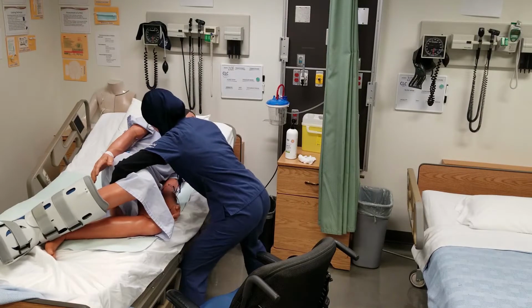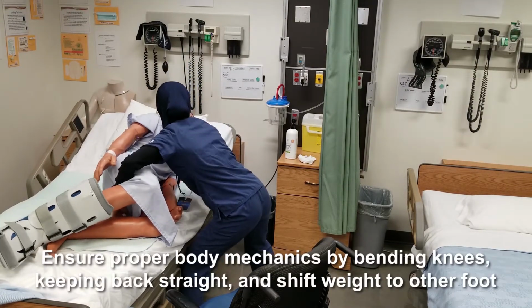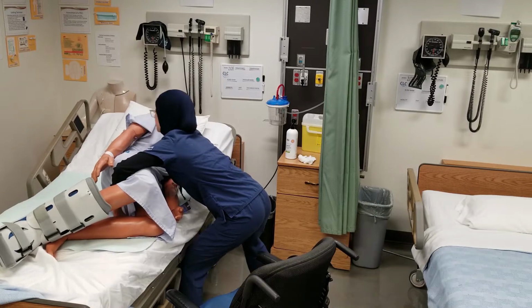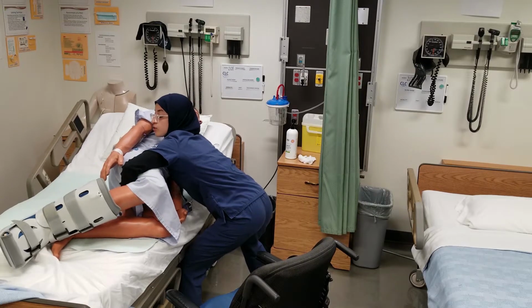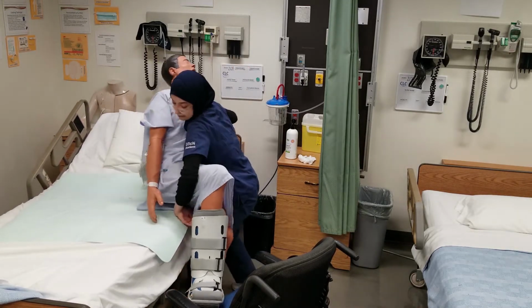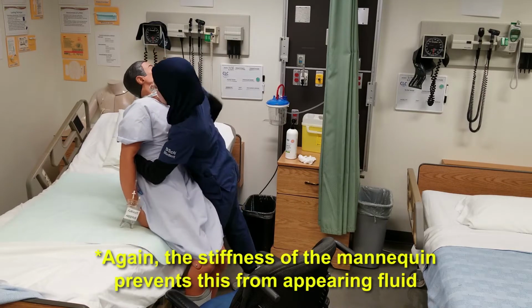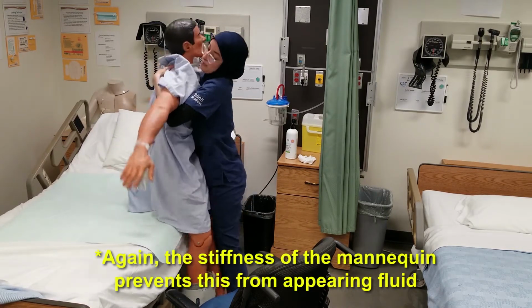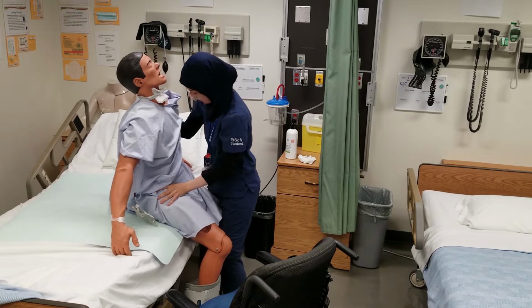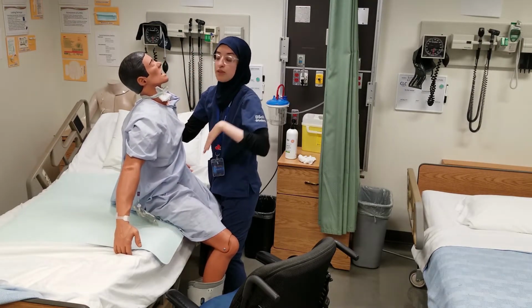Okay. So I'm going to make sure that I'm bending and I'm keeping my back straight. I'm underneath and I'm going to swing up on 3. 1, 2, 3. Alright. So now I'm going to make sure that the patient's legs are on the ground. So I'm going to move the level of the bed down.